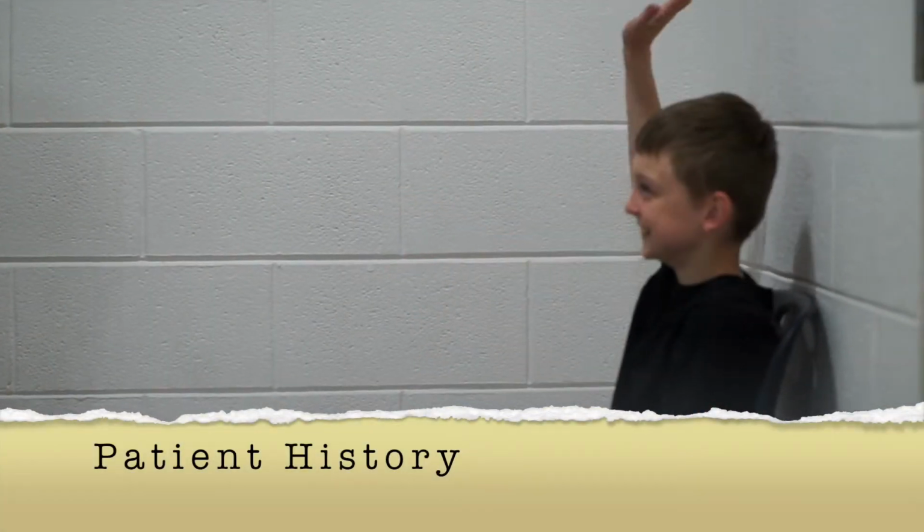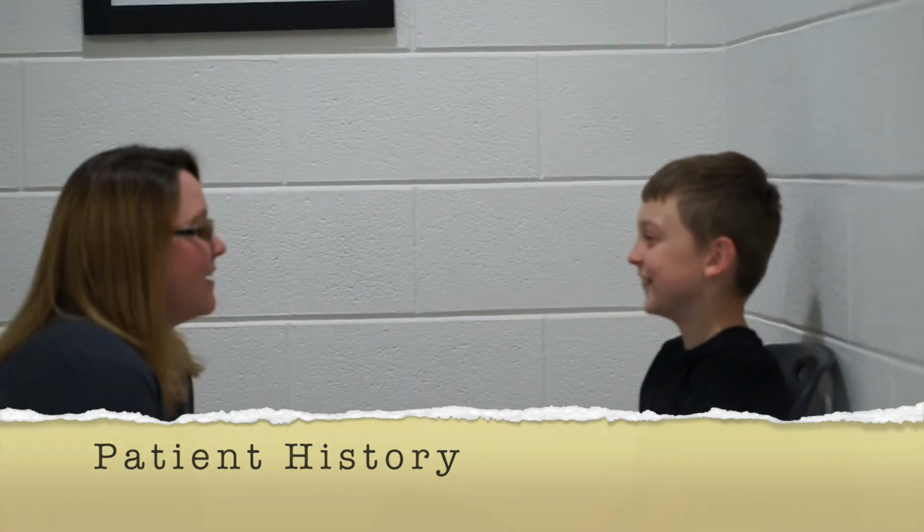Luke? Hi. Well, my name is Jen, and I'm going to be getting your x-ray today. Can you tell me your first and last name? My name is Luke Fire. And what is your date of birth? January 19, 2009. Good job. So what's going on with your ribs today?